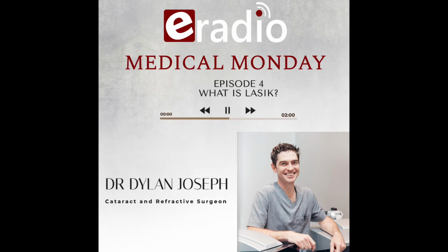So once the femtosecond laser has created this flap, which is constructed incredibly well, we can actually change the degrees of the hinge, for instance, where this flap is lifted up. We can make it 60 degrees, 70 degrees. We can change the length of the hinge. We can change the angle of the hinge, all just with computer programming. And once this flap has been created, the tissue is essentially already parted.